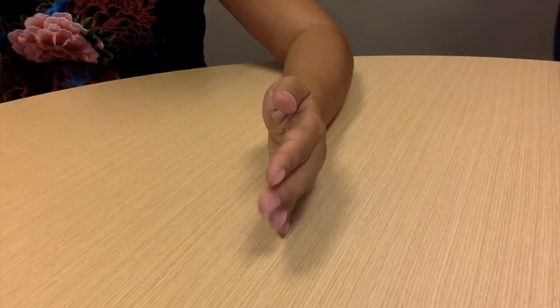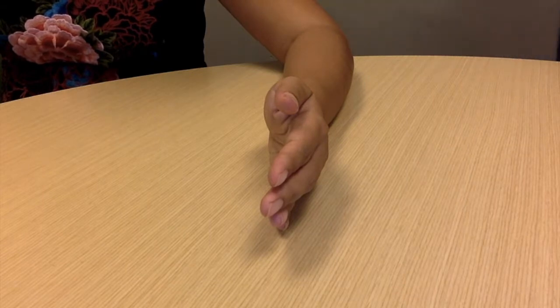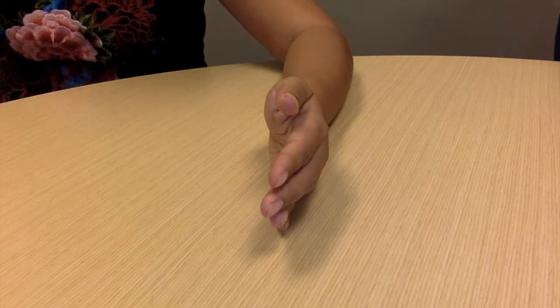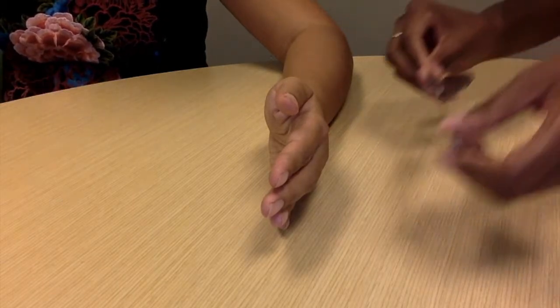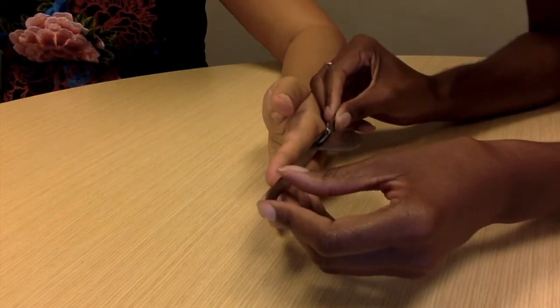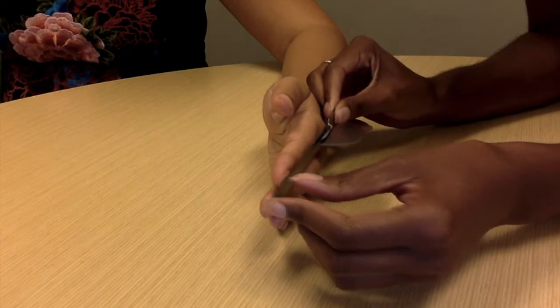MP flexion has a normal range of 0 to 90 degrees. The patient is seated with elbow flexed, forearm in mid position, wrist at 0 degrees neutral deviation, and the forearm and hand supported on a firm surface on the ulnar border. The axis is placed on the dorsal aspect of the MP joint. The stationary arm is on top of the metacarpal. The movable arm is on top of the proximal phalanx.